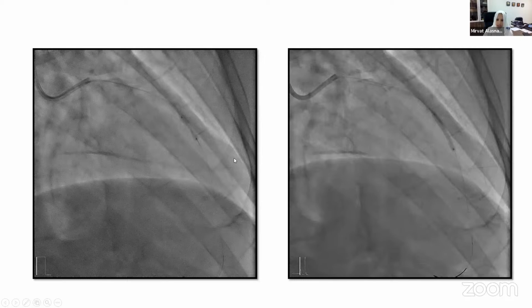And we started to dilate, and you can see here that there's a waist, although this was not the calcified segment, this is fibrotic. So the fibrotic does need sometimes modification. You may need cutting, high pressure balloon, and so on, until it finally yielded. And then we went ahead and started stenting.